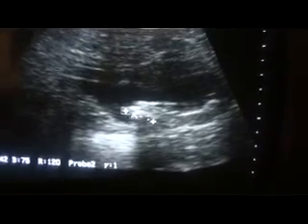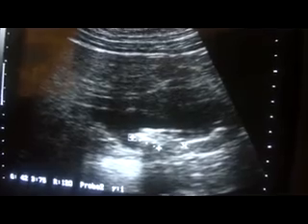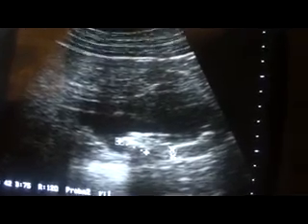proximal ureter. Or you can otherwise say a calculus measuring 18.5 millimeters is seen in the region of the pelviureteric junction, and as a cause of this, dilation of all the calyces. So this is the right kidney. This is the third finding in this patient.